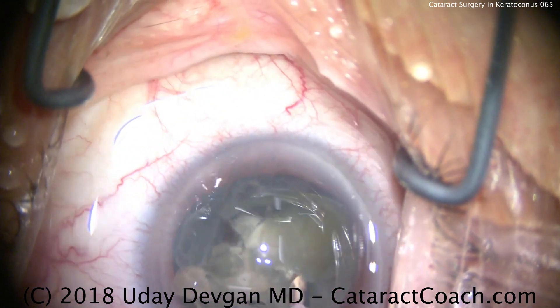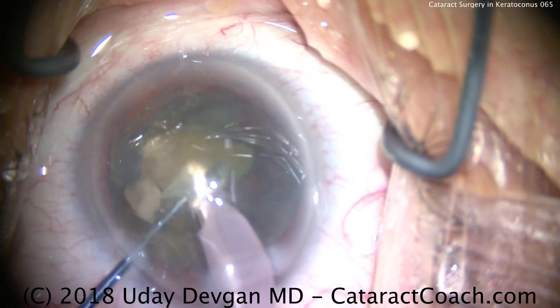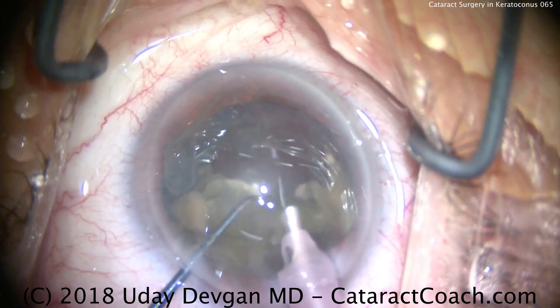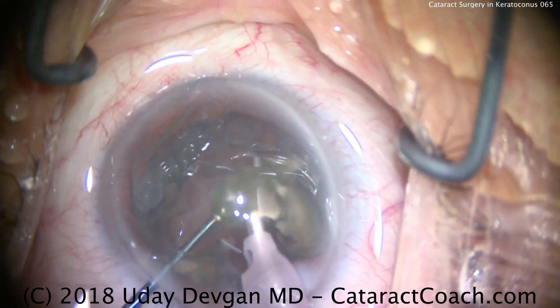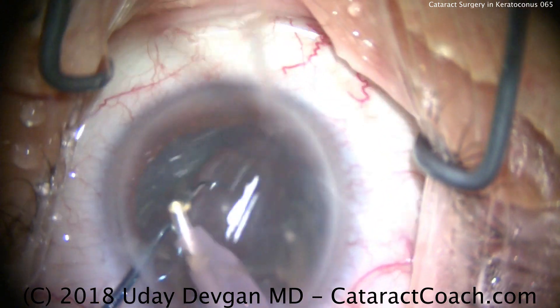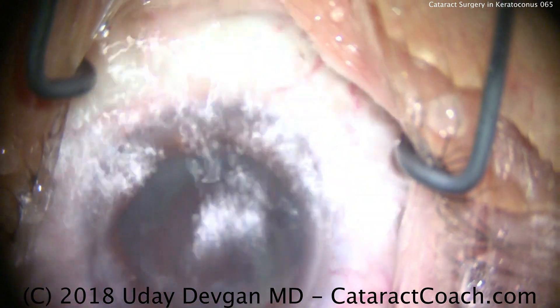Now let's talk about lens calculations. How do you do IOL calculations in a patient with keratoconus? It's easy enough to measure the axial length, but what's tough is the accurate corneal measurement — the corneal power, keratometry — especially in the center of the cornea that the patient is looking through. There may be a very steep inferior portion; what matters is the central portion. So for this, I use multiple different measurements: the biometer, topography, tomography, and auto keratometer. Take as much data as you can get, and try to figure out the central corneal power.